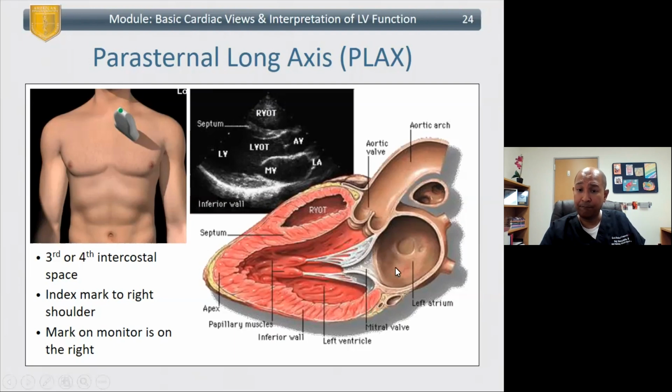Here's your left atrium, here's the left ventricle, here's the intraventricular septum, here's the right ventricle, and here's our left ventricular outflow tract, and here's going to be the mitral valve, there's going to be the aortic valve. The mitral valve will always have 2, the anterior and posterior leaflets. When we think about it, the anterior leaflet's always going to be closest to the aorta. I always think about A and A. And the posterior leaflet is going to be over here, as you can see with the pointer.